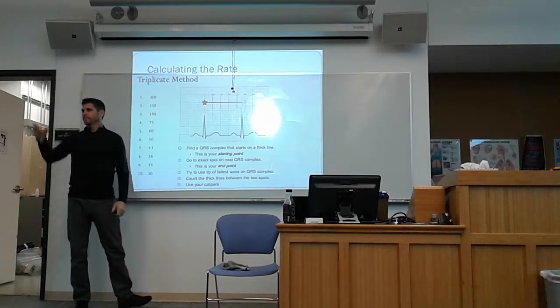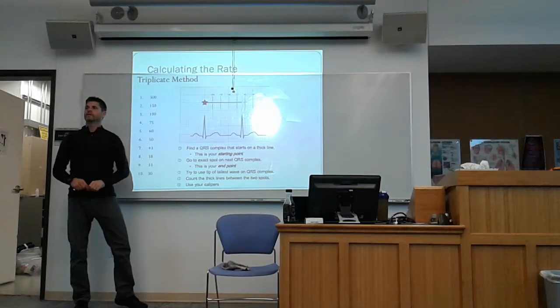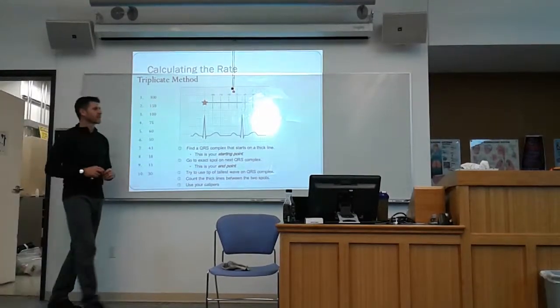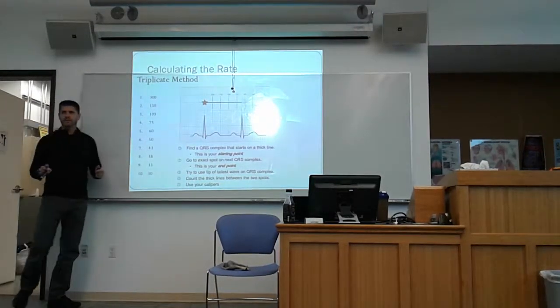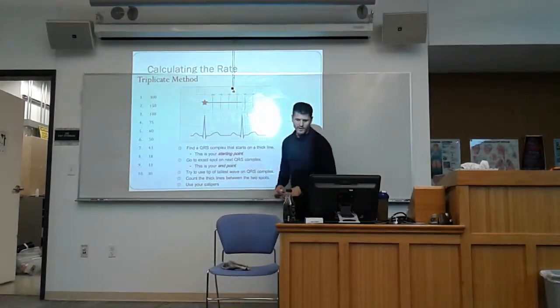You said it only works on a regular rhythm. Does it work on a regularly irregular rhythm? No, it works on a regular rhythm. You have to make some mental adjustments if it's a regularly irregular or an irregularly irregular rhythm, which we'll discuss in just a minute. Questions on that method? Okay, that's one way to do it.